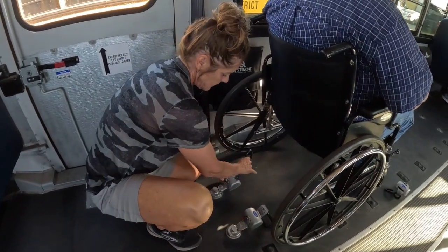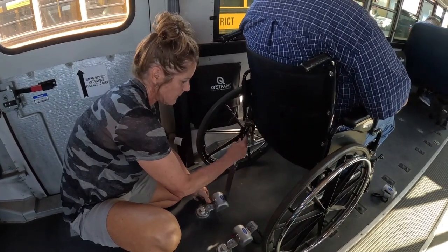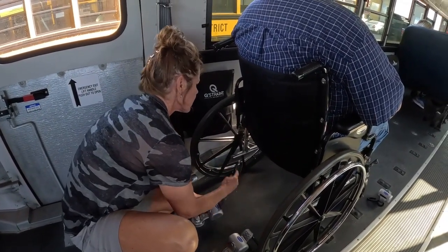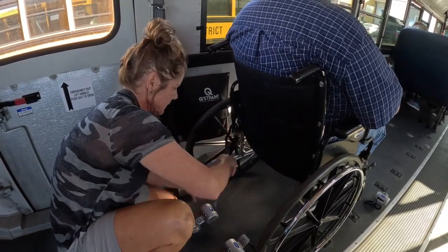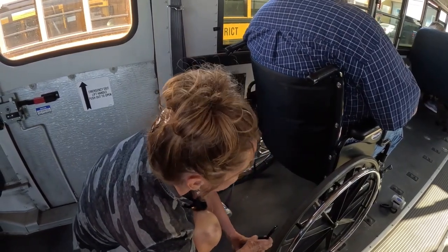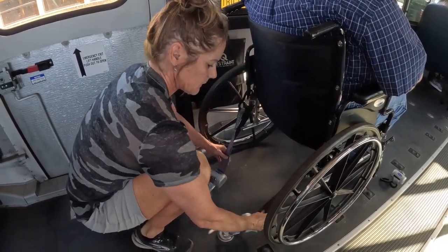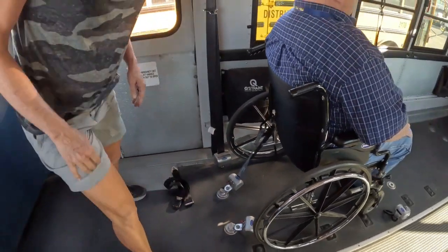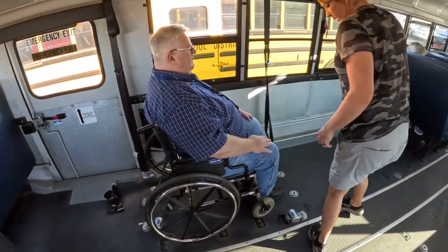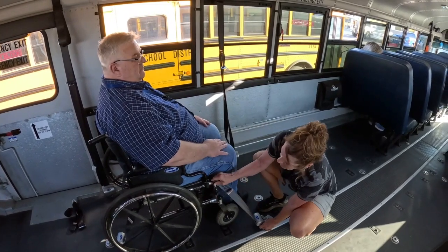These are your hooks. The red knob is what releases them. You're going to want to strap it on there. You want to put them on the closest joint to the seat. And you can tighten them just by pulling on them. Same thing here, the joint closest to the seat where it's not going to slide.